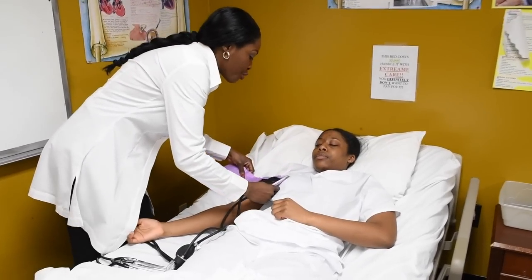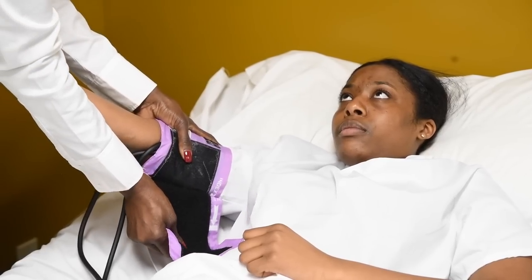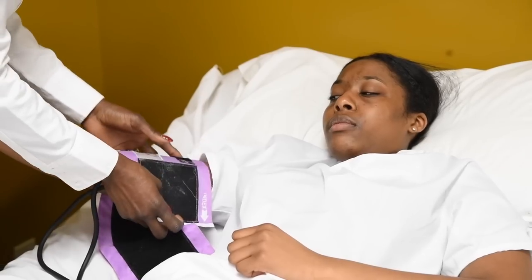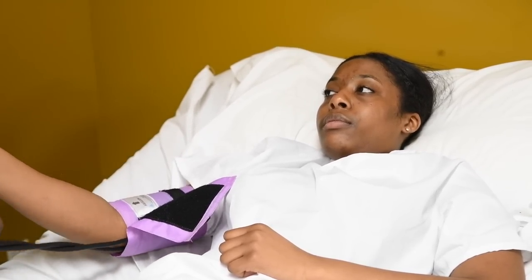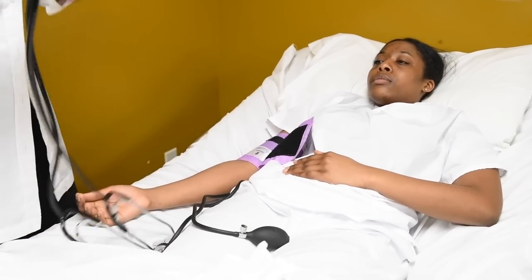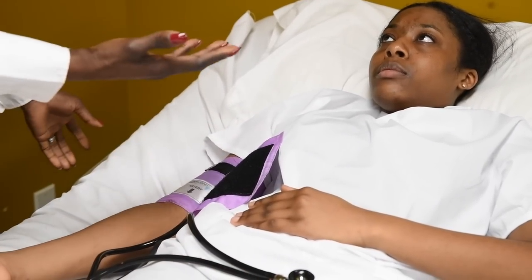Take my cuff and wrap it snugly. Remember that word? So this is what I'm doing, snugly. Sometimes when I'm testing students and they wrap the cuff and it's a tiny bit loose, they get all bent out of shape, trying to take it off and wrap it again. Just do this. And the more you practice, the better you become, like I just said, all right? Just like that. And it's facing you, okay? You rest the patient's arm on the mattress. We said this part is what goes in contact with the brachial artery. So certainly you do not want to cover the brachial artery.